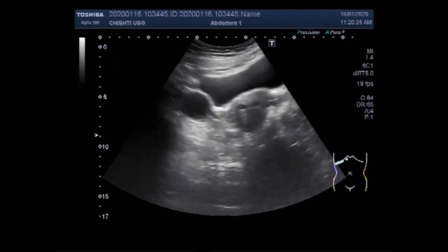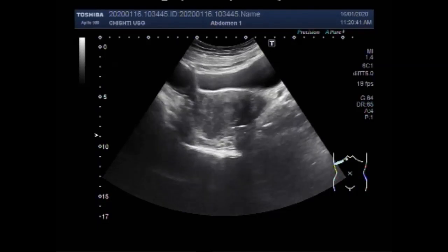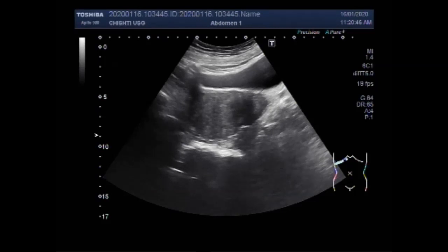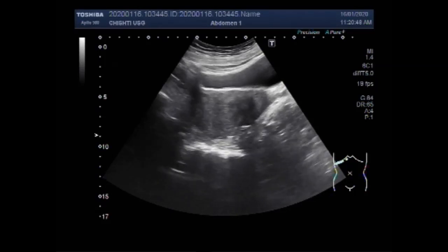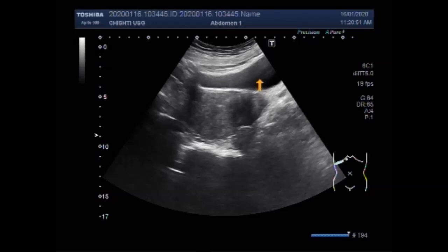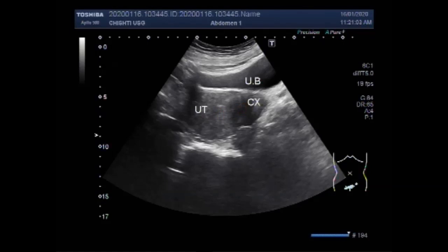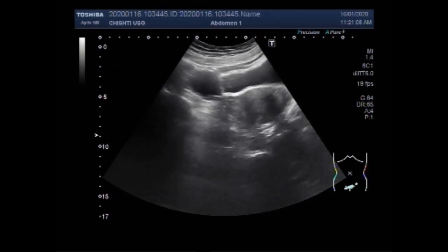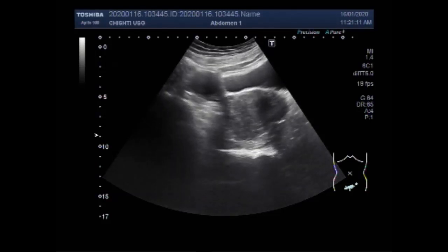This ultrasound video shows two ovarian cysts: one is a simple ovarian follicular cyst, and the other is a large hemorrhagic ovarian cyst. You can see the uterus, cervix, urinary bladder, and left ovarian cyst.